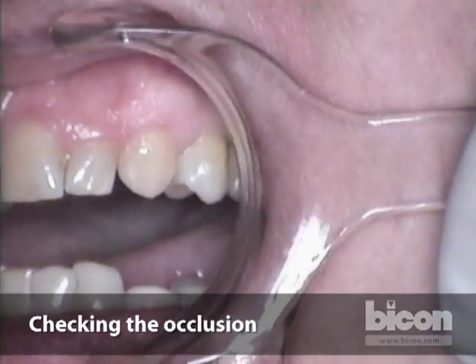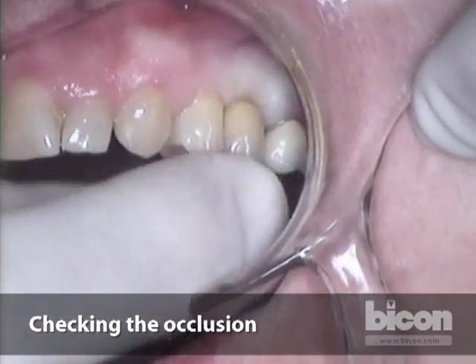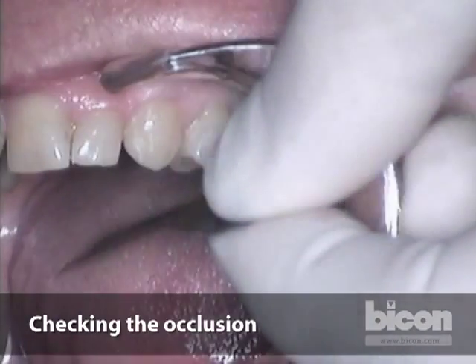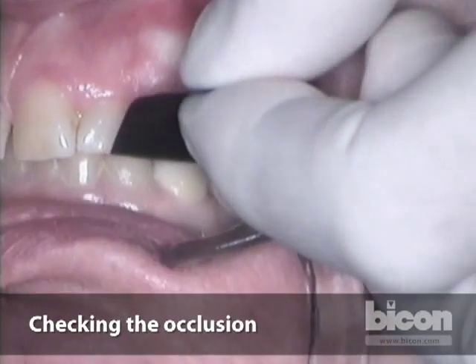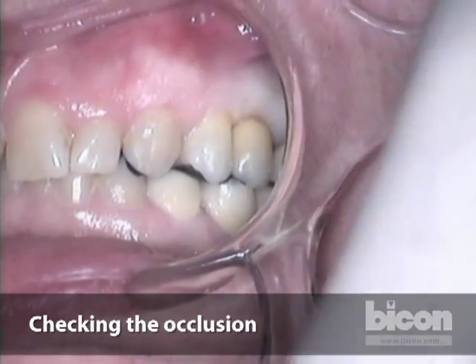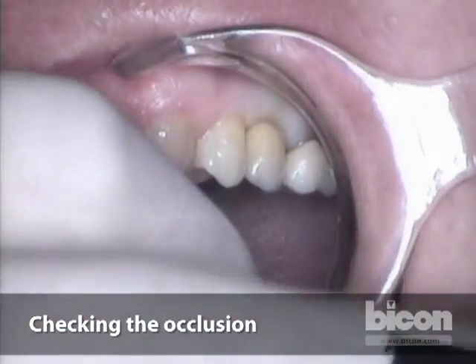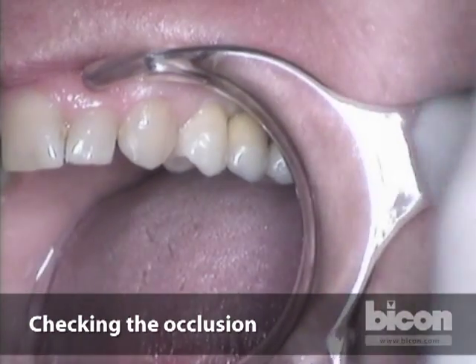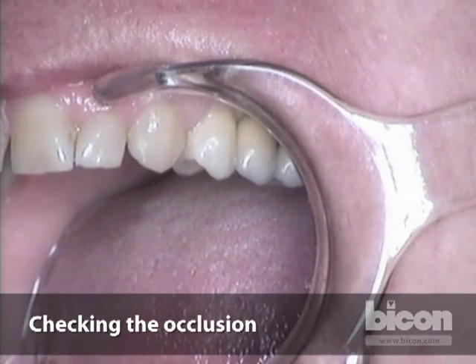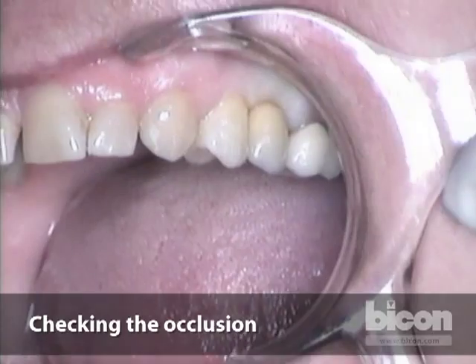A little high. Let's check and see if it's closed. It can't be too high, so we'll make a little adjustment. The beauty of these indirect composites is the fact that you can adjust and polish them completely in the mouth.